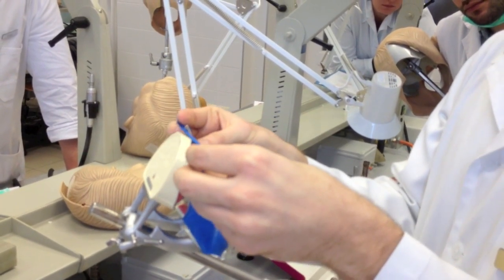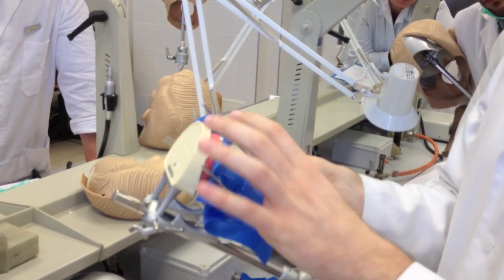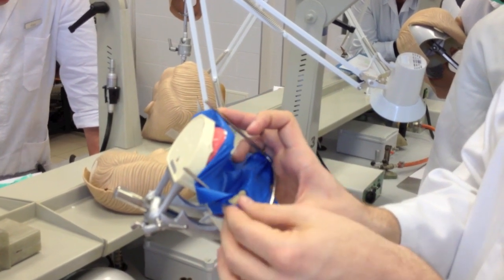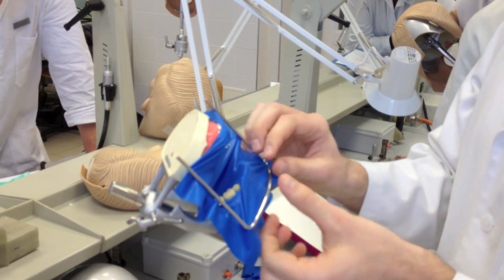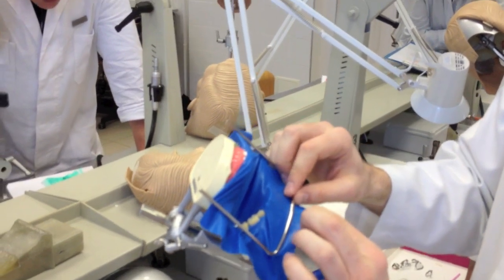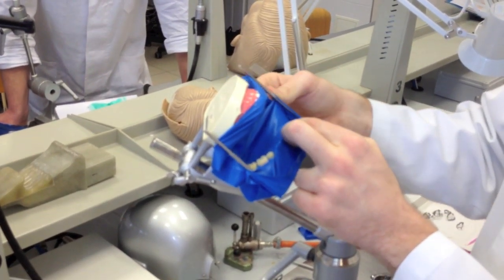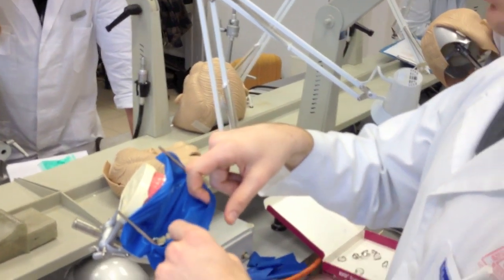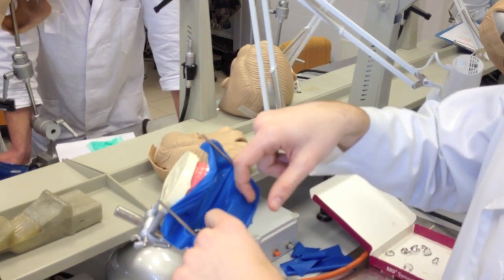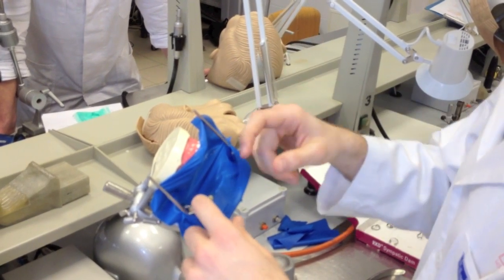First the upper ones, then the lower ones. There are some small spines here that will help you to fix the rubber. If you have enough material, you can make a small pocket at the bottom. If you use any liquid, it's not going to flow down on the patient's chest — it will be collected here. Or you can even place cotton rolls here and replace them during the process.